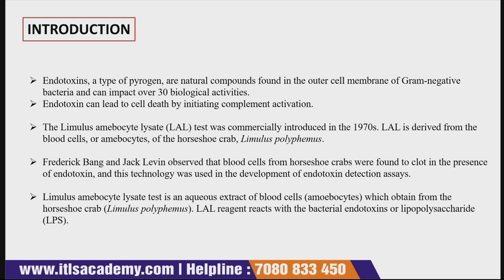So it was first introduced commercially in the 1970s, and it is also known as the LAL test, that is the Limulus Amoebocyte Lysate test, and it is derived from the blood cells, or amoebocytes, of a horseshoe crab, that is Limulus polyphemus.